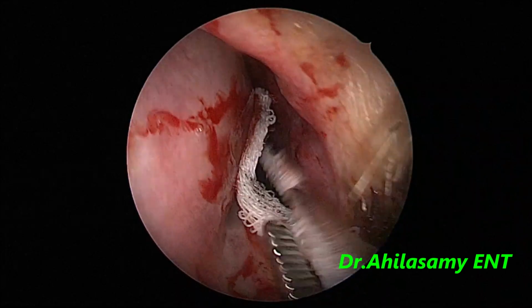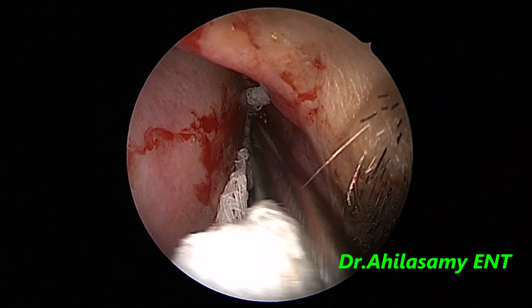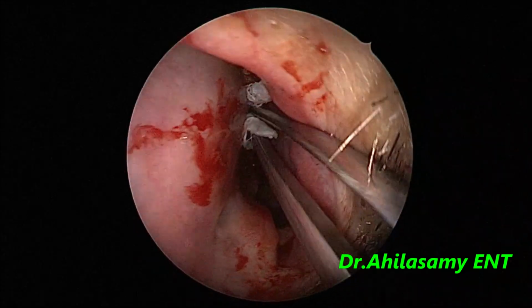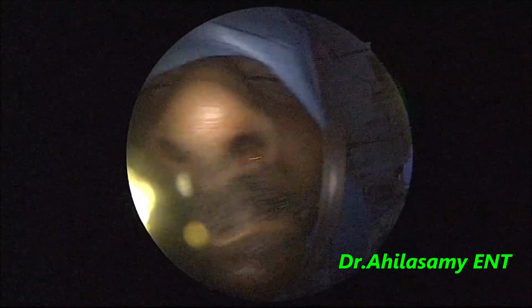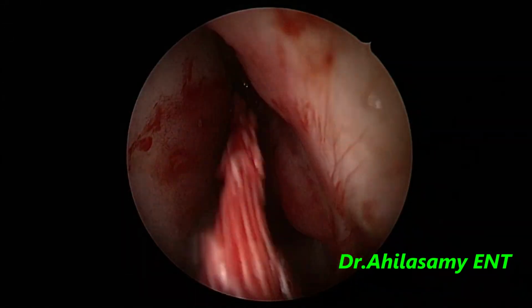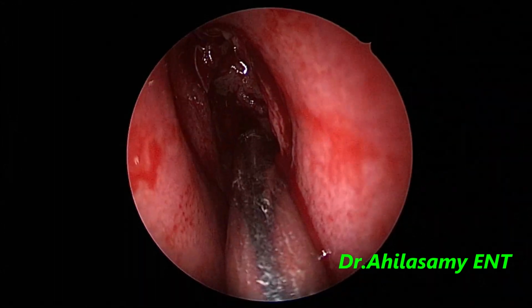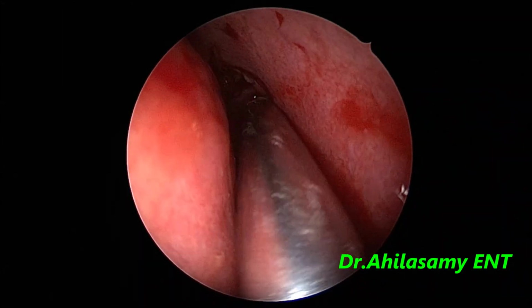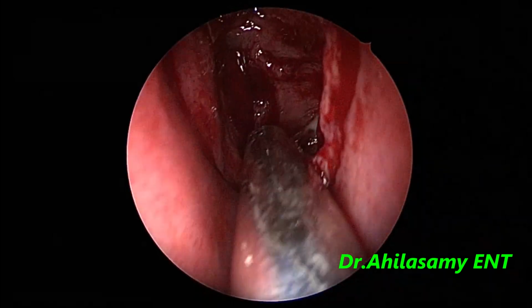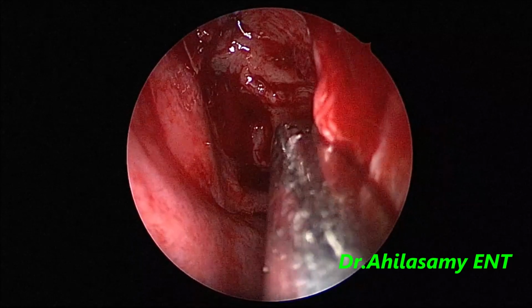Even though the spur is there, I'm not going to remove it. Since it's a little bloody, I'm repeatedly packing that area with roller gauze soaked in the same 4% lignocaine adrenaline to get a better field. So when the field is a little bloody or bleeding, you repeatedly pack the area with roller gauze soaked in 4% lignocaine and adrenaline.